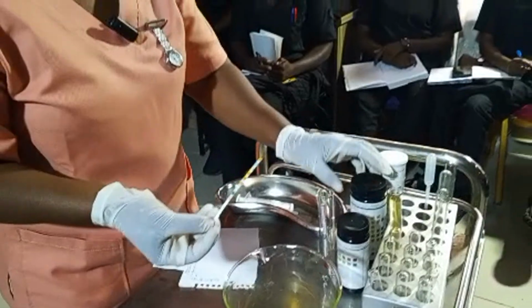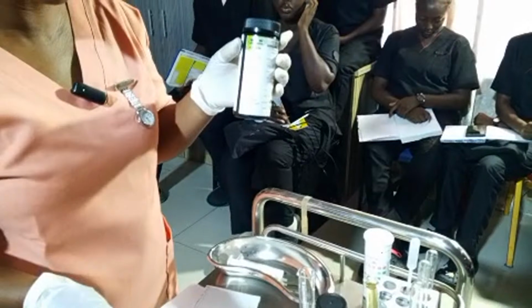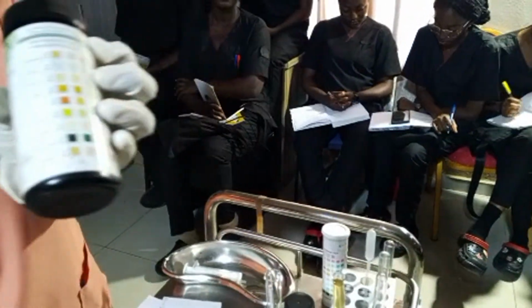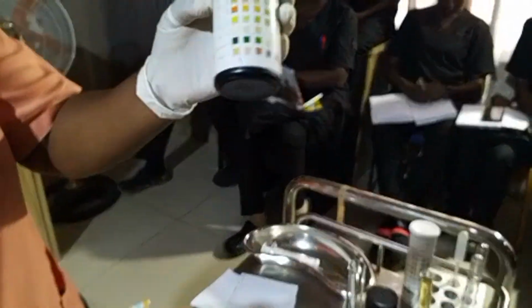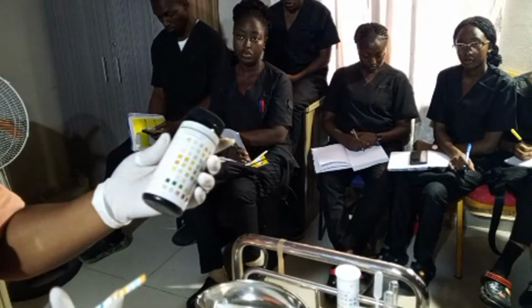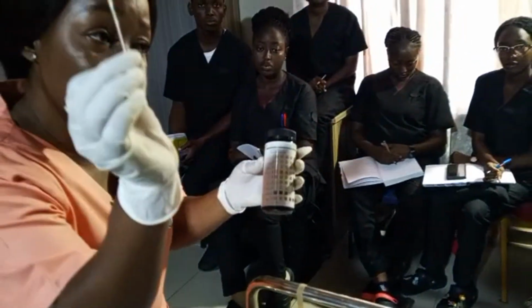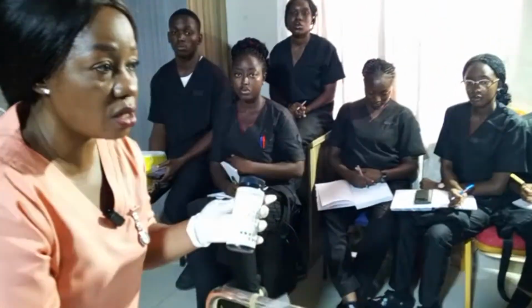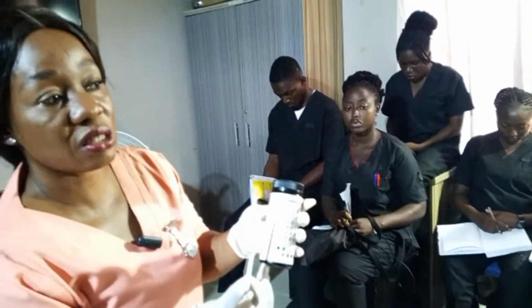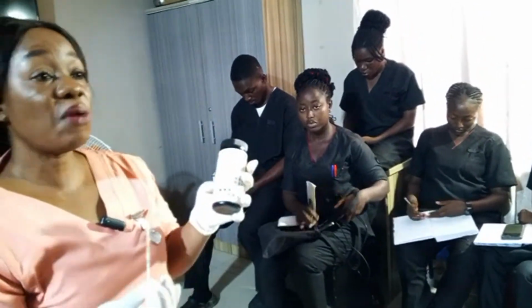So now, as I told you, follow the instruction of what? Manufacturer. So when you look at this container, you will see some minutes, seconds being placed directly to the colors. So you are going to use this strip that you dip inside the urine to compare the colors on the container as has been instructed by the what? Manufacturer, right? Can we look up, please?